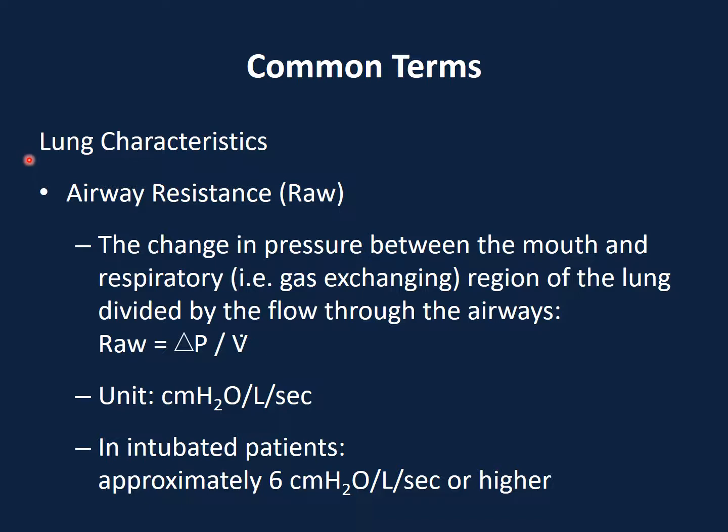For lung characteristics, another one would be airway resistance. So we're talking about the change in pressure that is divided by the flow through the airways. In other words, how much pressure is required to pass through a certain cylinder.